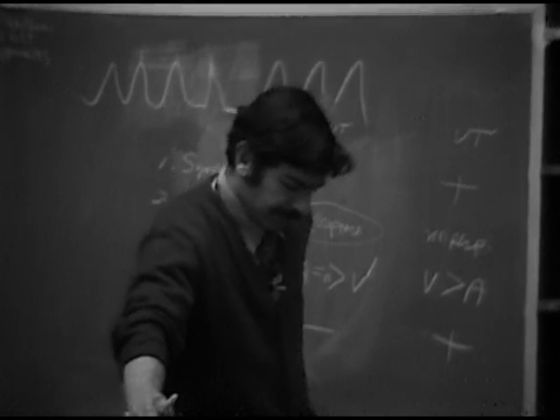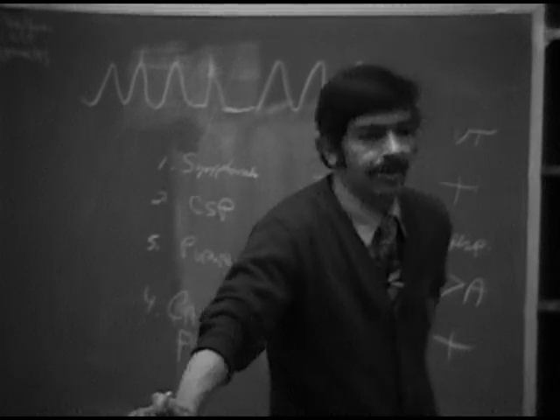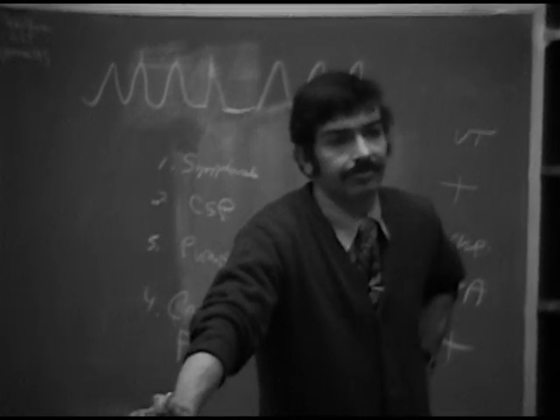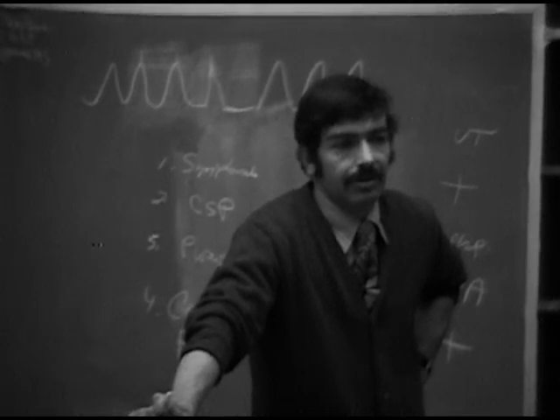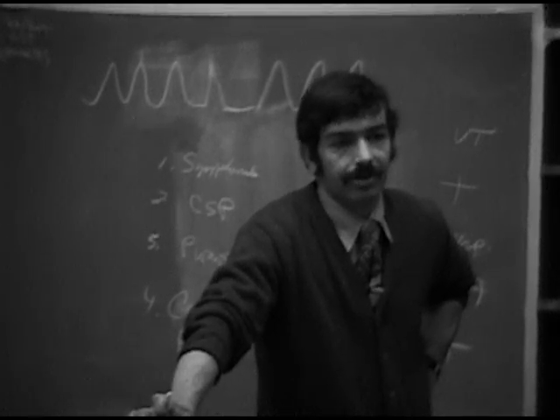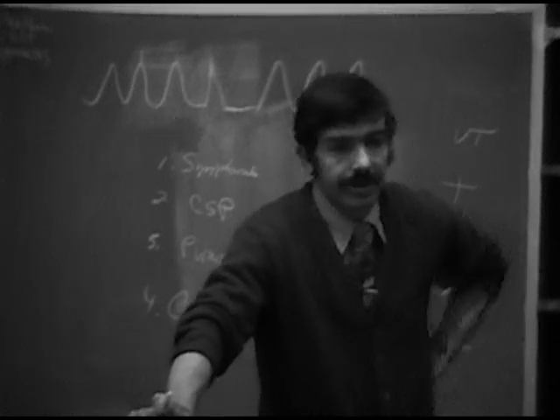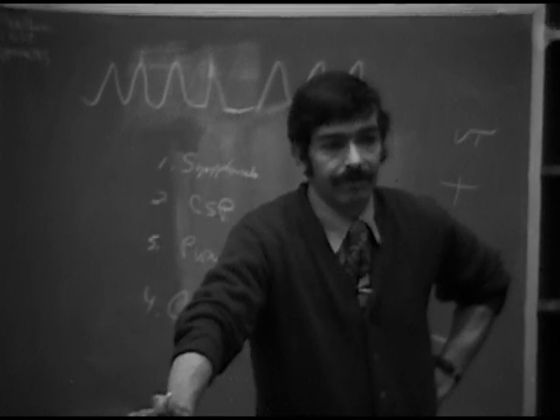If you had a long enough strip, would they occur in a regular pattern? Some patients with ventricular tachycardia may never have capture beats. And most of the ones that I have seen are really just random things. They just come in. Occasionally you'll see a patient with a fairly regular intermittent capture. I think that it varies.